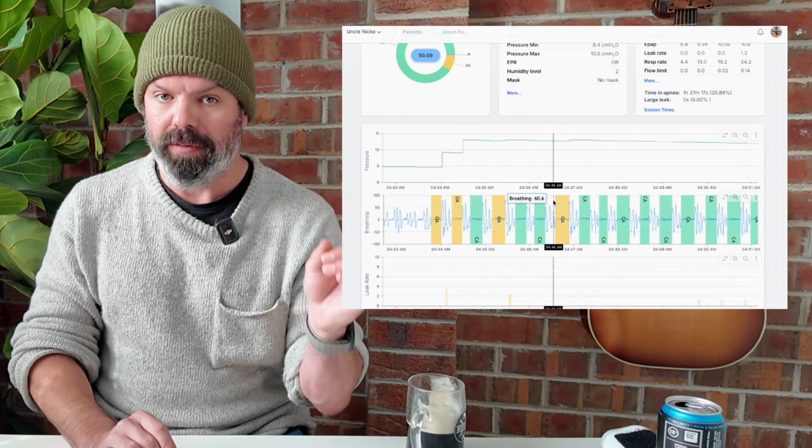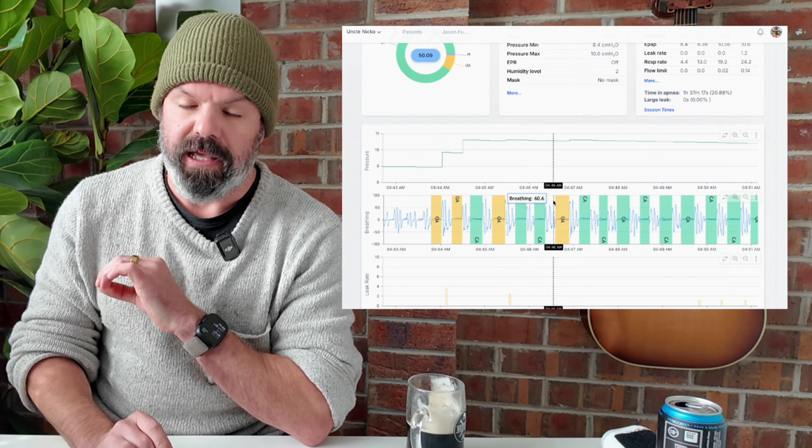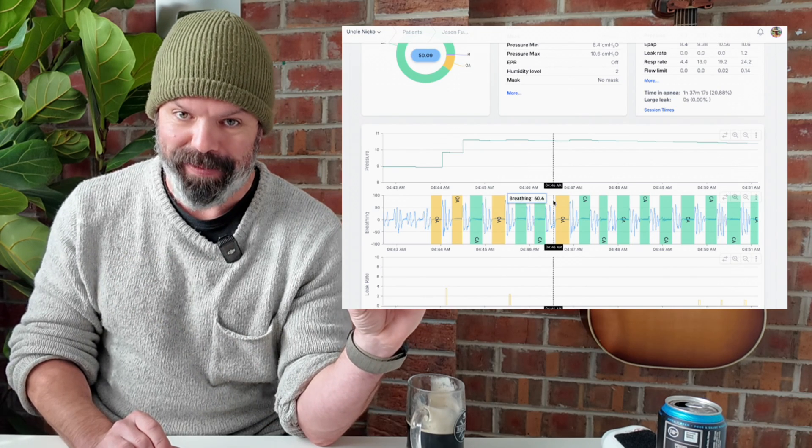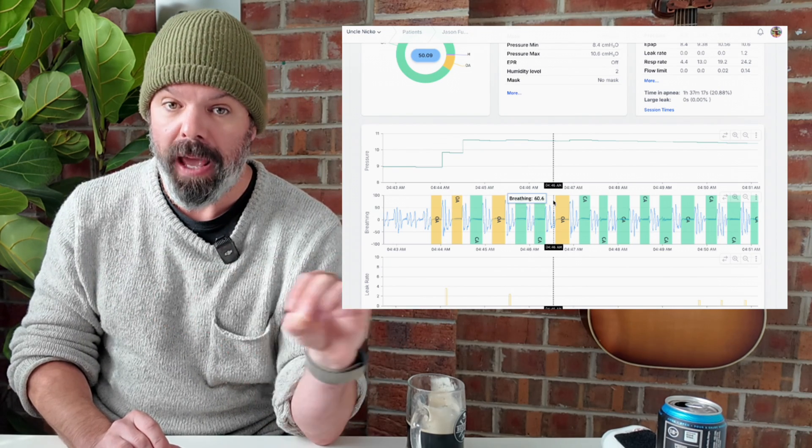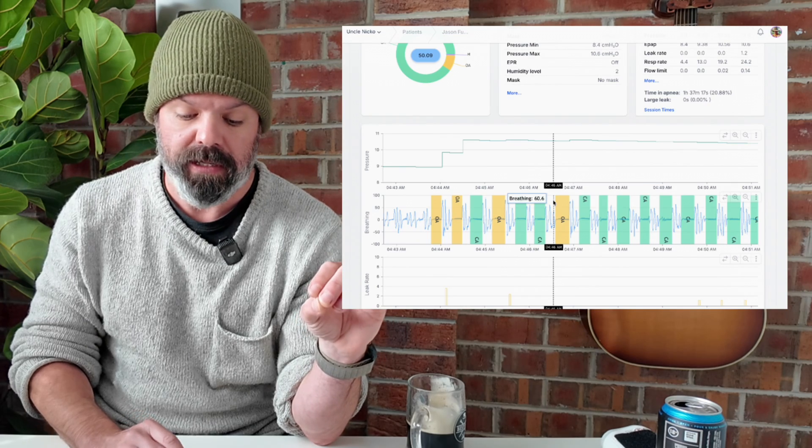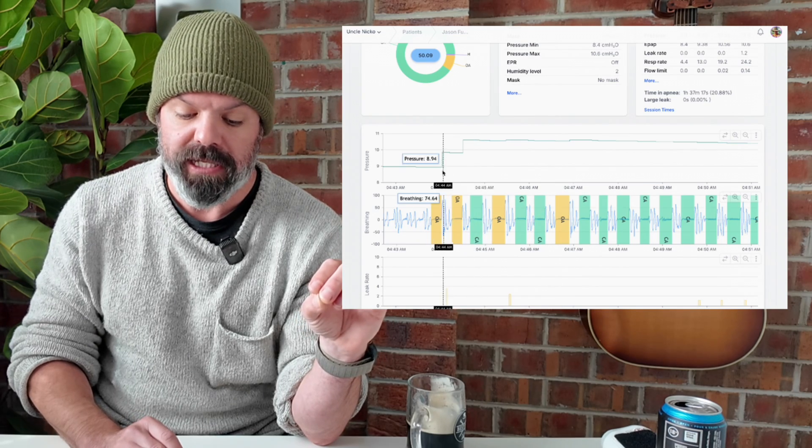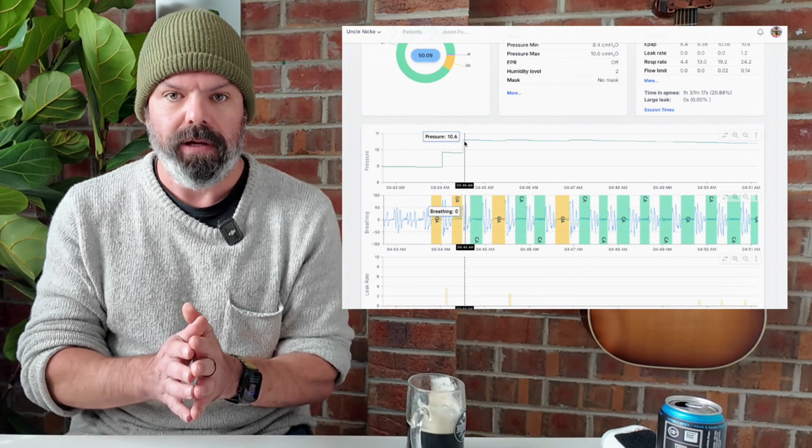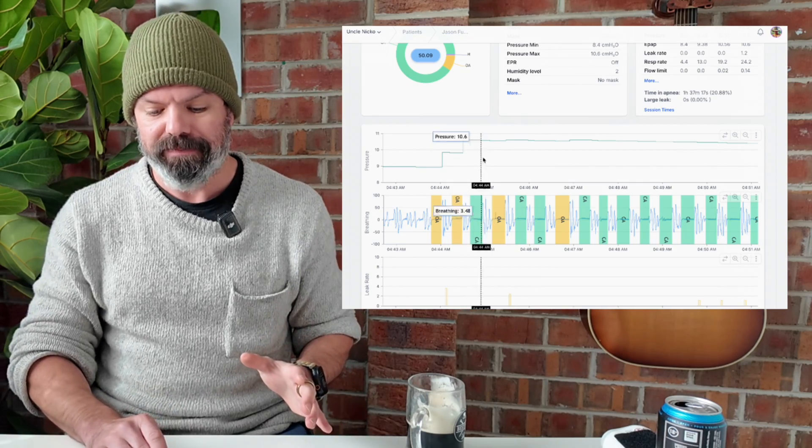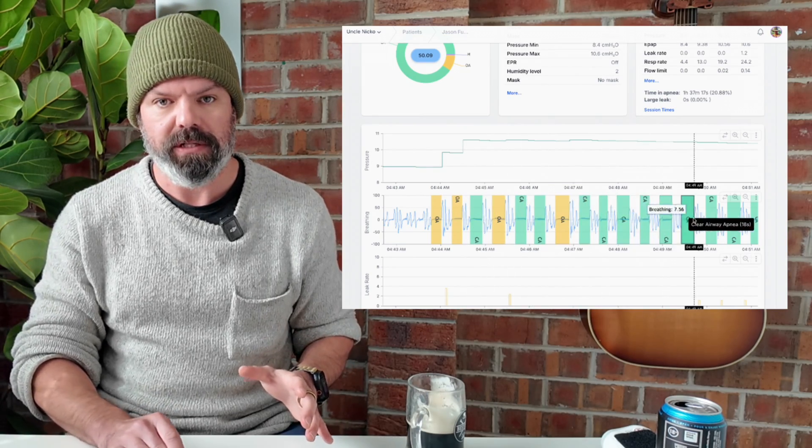But the big problem is this guys. These are not obstructive apneas. They're clear airway, just like the rest. So these pressure jumps are not going to do anything. As you can see, it doesn't change anything because there is no obstruction. And this is just one of the many flaws associated with automatic pressure delivery. A lot of the time the machines get it wrong, and when it gets it wrong, it causes all sorts of issues.